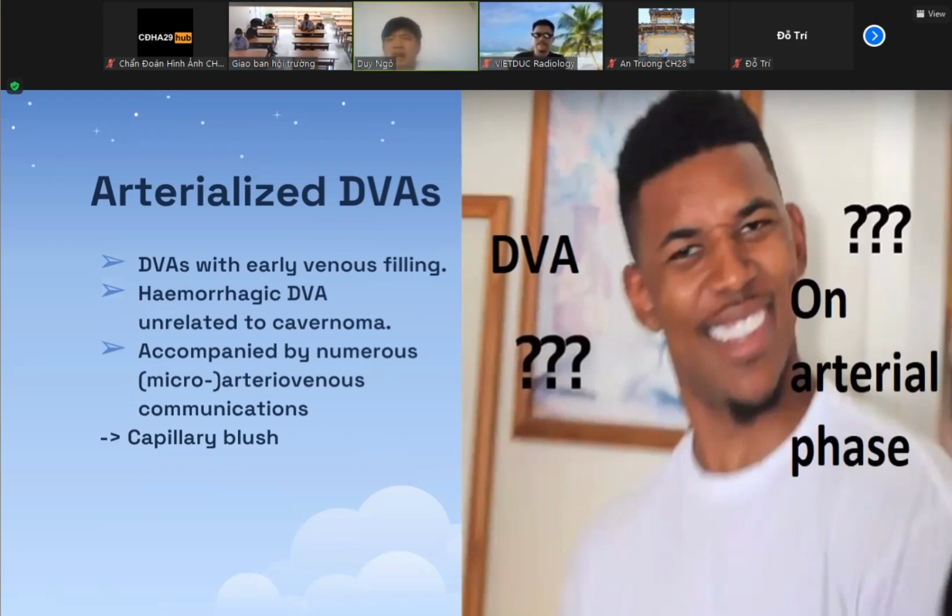That kind of abnormality sounds a little bit crazy, right? Because we are talking about a venous abnormality that can normally only be seen in the venous phase of DSA. But now we are talking about DVA on arterial phase.